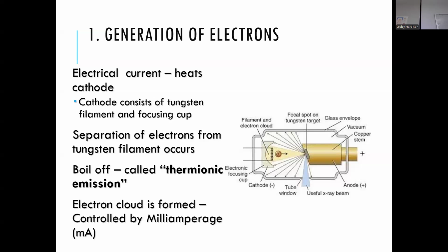Did you also say that the MA controls the heating up of the tungsten filament? It does. Yes, it controls that whole process. Yes.